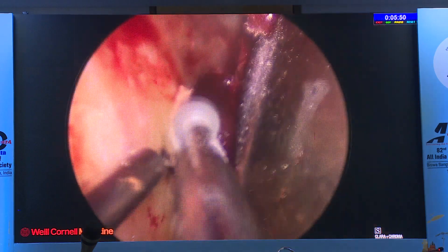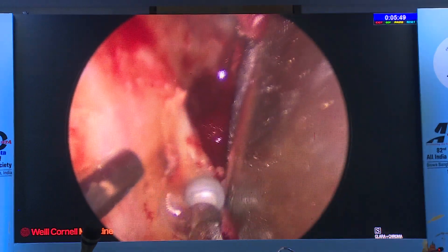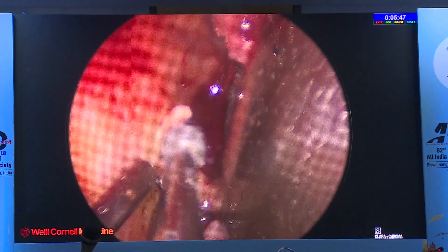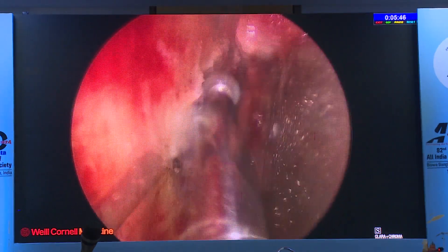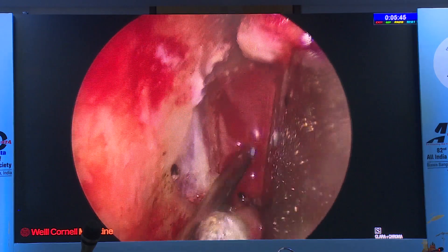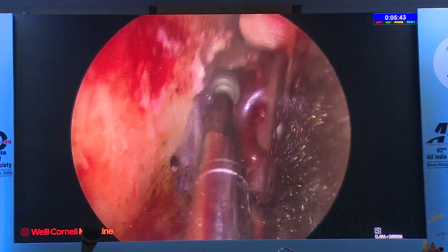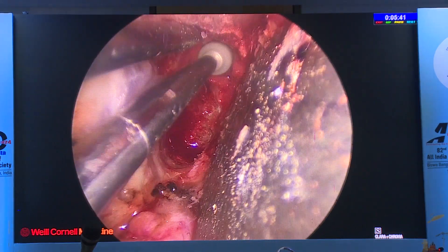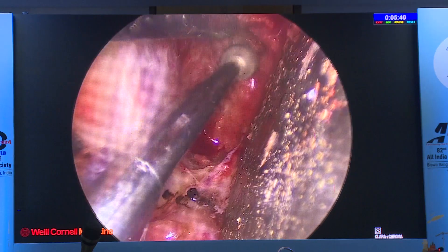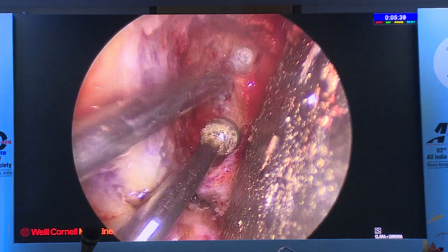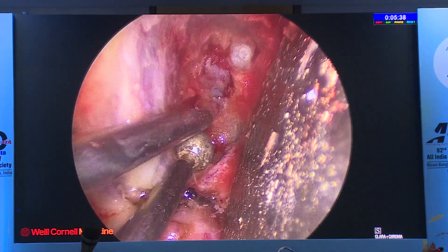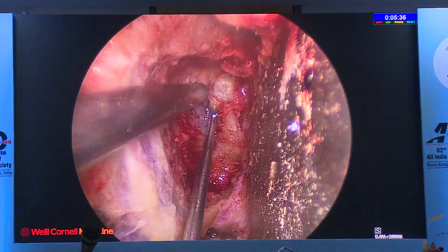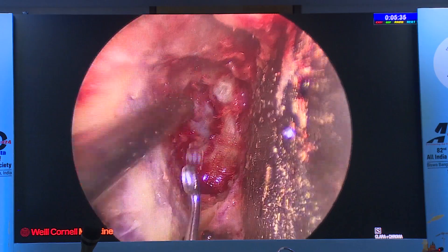This one requires opening the dura. The hand-over-hand drilling technique with endoscopic visualization provides high magnification and nice resolution, allowing you to safely remove all of that bone once down to dura without risking injury.